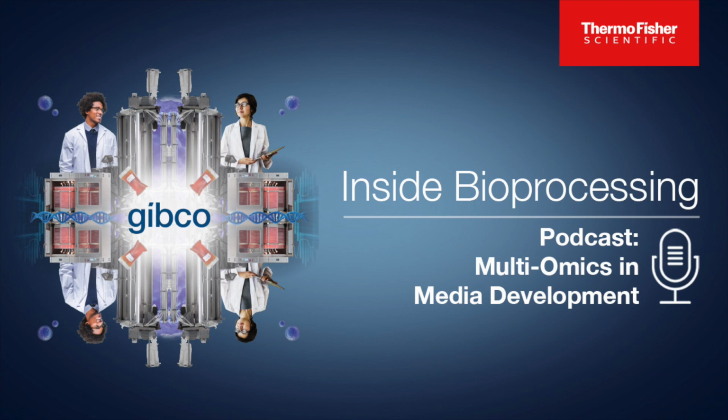The limitations really are about you're looking at just the spent media. You're not actually looking at what the cells are doing with those metabolites. So really, all you're seeing is a limited amount of components, maybe 30 to 50 components in total. And you're seeing that, okay, well, cysteine is running out, but you're not seeing what that cysteine is being used for by the cell.